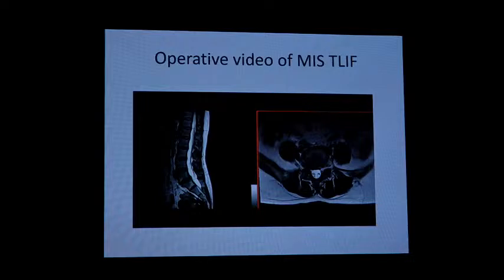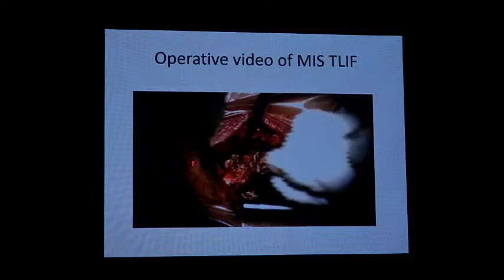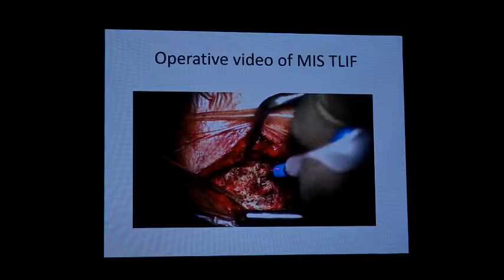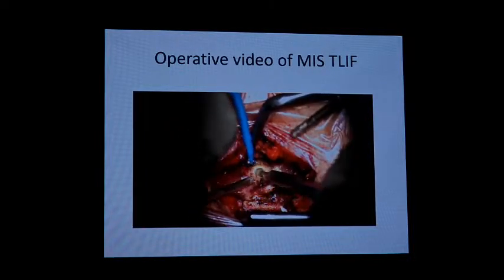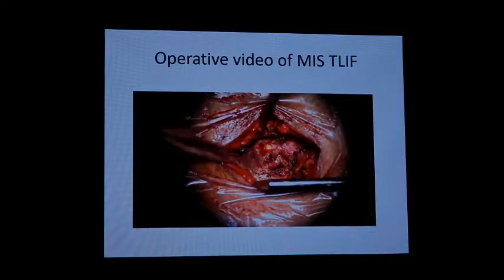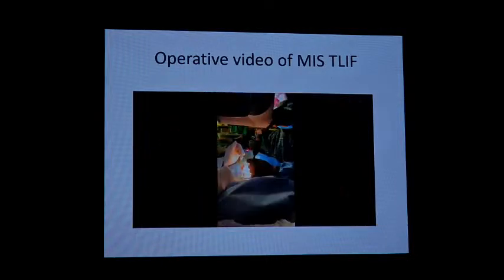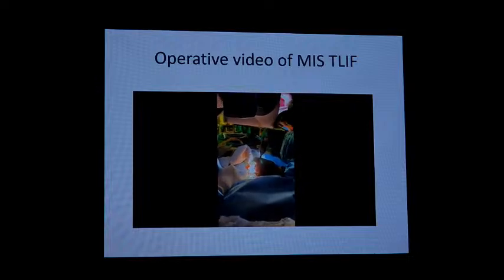So this is a patient who had presented with back pain. She had an L5S1 listhesis and pars fracture. We can see this is through a midline approach, which Dr. Vijesh had discussed in detail. This is the inferior articulating process, and the lamina is drilled. Then we are positioning the chisel to do the removal of the inferior articulating process. So using a chisel helps us to save a lot of bone.